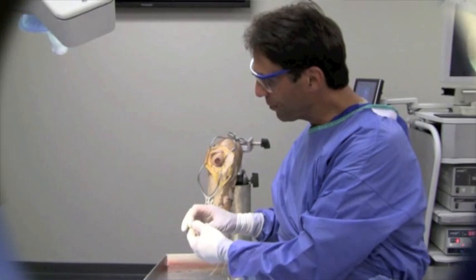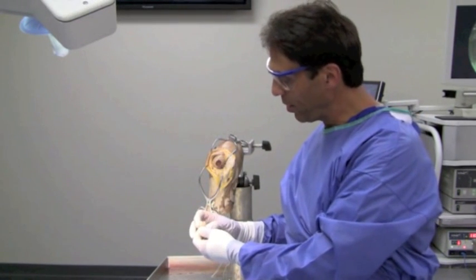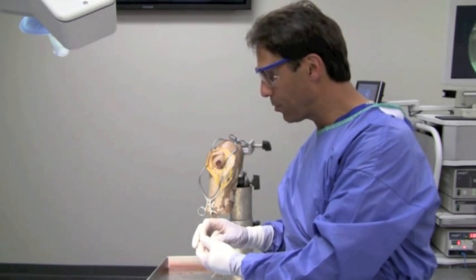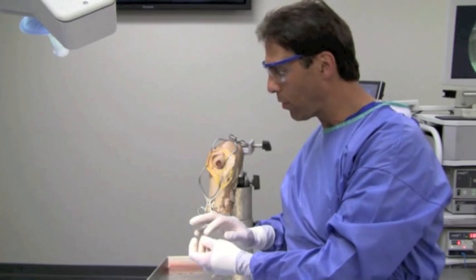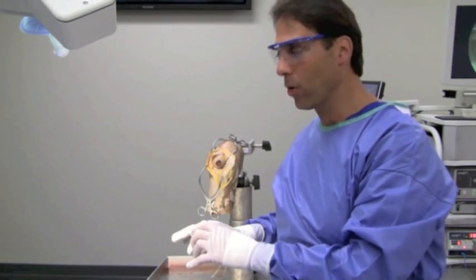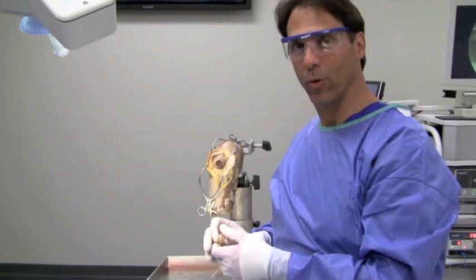So this is our plug. I've tapered it down so that it should fit nicely into the recipient site there. And then the one thing I would do here if I was in a real operation is I'd take a special water pick device and flush this graft as much as I possibly could of all the cellular debris, of all the marrow contents. That reduces the risk for the body to recognize it as being a foreign material and mount an immune reaction to it.